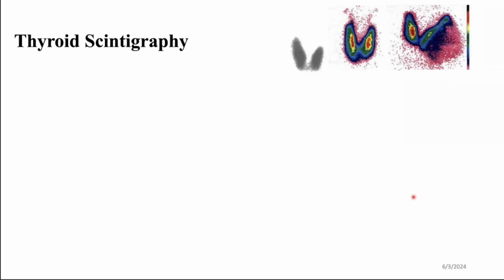We'll move on to thyroid scintigraphy, which is an example of a nuclear medicine scan. So it's different from ultrasound, different from X-ray, different from CT. Did anyone talk to you about nuclear medicine in general? Did you take any lecture about nuclear medicine? Yes. Okay, excellent. So you have some information about it.